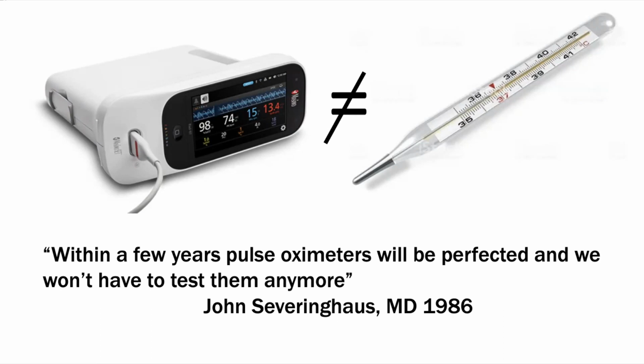It's virtually unaffected by anything. We have, as clinicians, many times assumed that pulse oximeters are the same. That's a fundamental issue that we need to address. It kind of goes beyond regulation. There's no regulation that's going to address that concept. It's a matter of education that we all have some responsibility to advance.